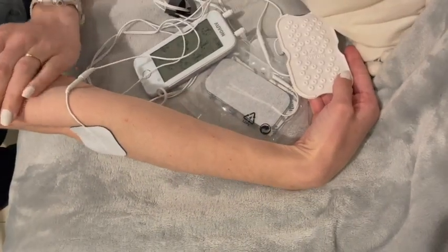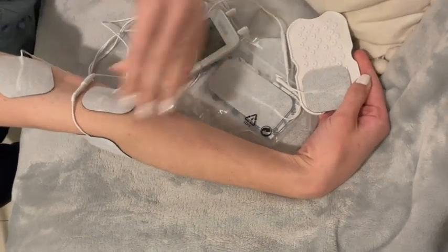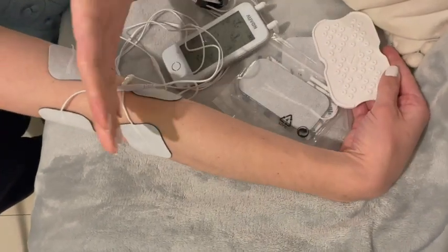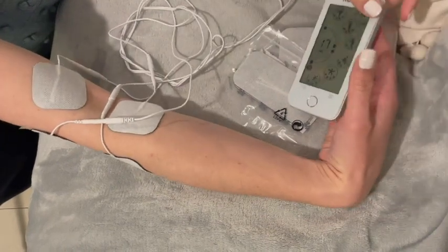What you want to do is you want to cross section the pain. With B, I would put it here and over here. So remember, the original pain is right here in the middle. Now I have this great cross section that is going to be perfect to really target that pain.